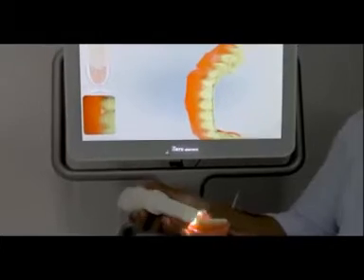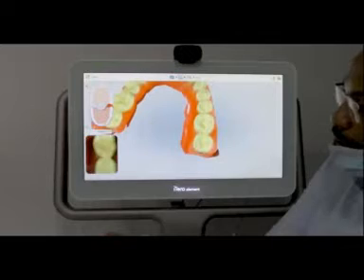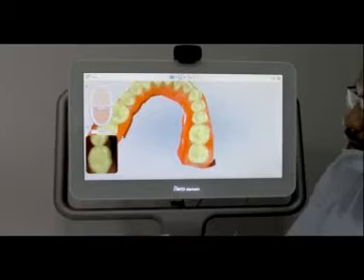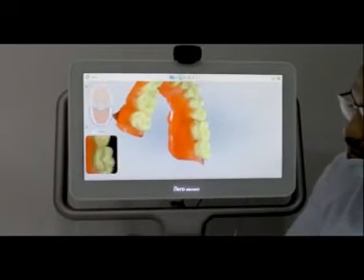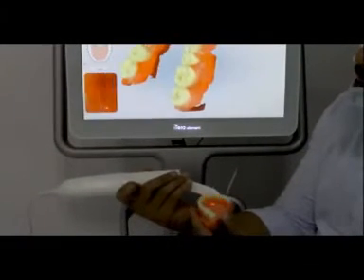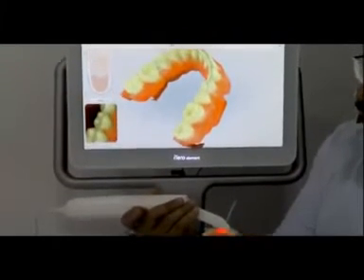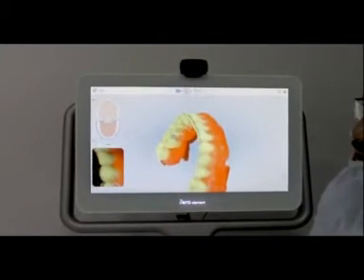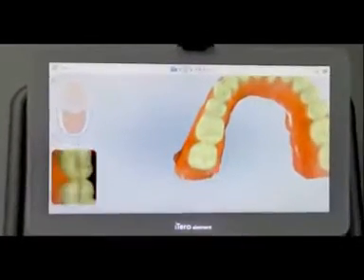The thing I'm looking at is this viewfinder here. You want the occlusal surface in the middle of the viewfinder, and the same if I'm going lingual or buccal, because sometimes if you start moving around like this, it's not going to scan. You also want to catch a little bit of the gingival margin. About 2 millimeters is fine.